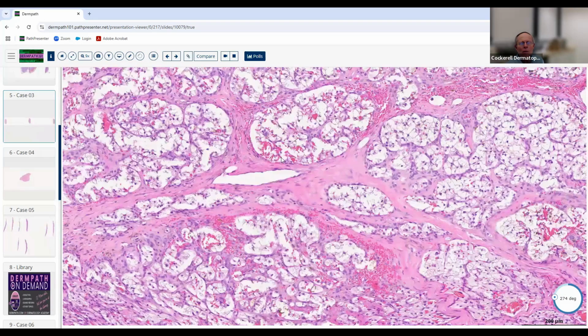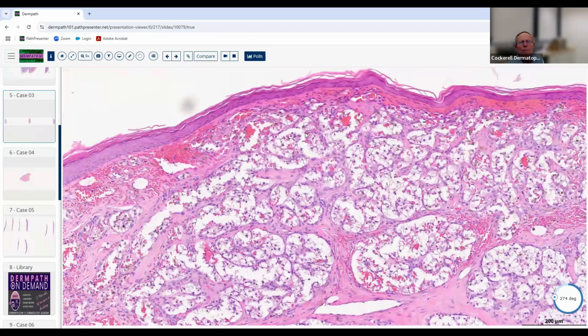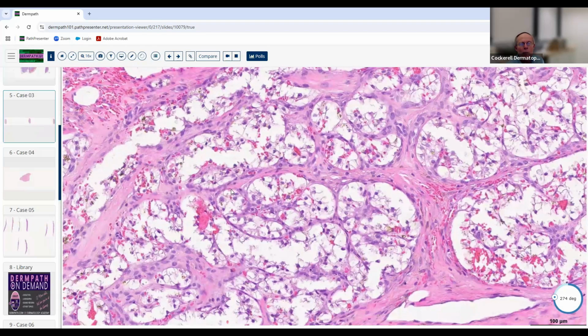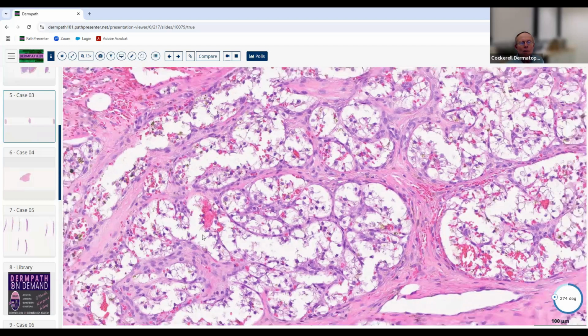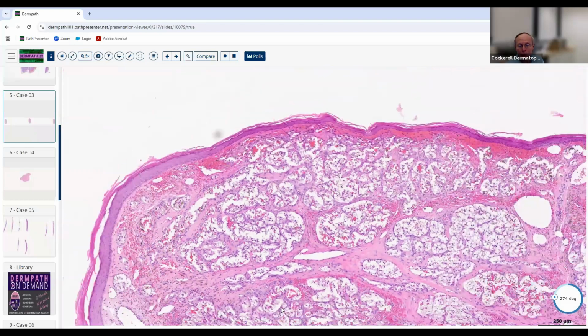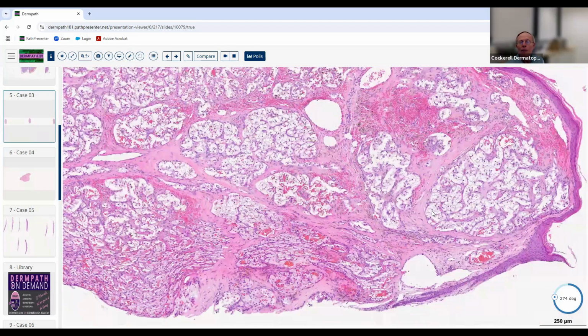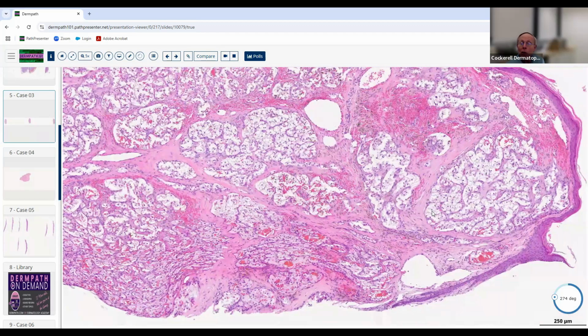They don't look like sebaceous cells, which can be clear staining. They don't look like histiocytes that have a bunch of lipid in their cytoplasm, and all these red blood cells here. And if you look at this little structure here, it's almost recapitulating a nephron in the kidney, like a collecting tubule, if you will, right in this area. So this is an example of a metastatic renal cell carcinoma, and it's one of the entities in the differential diagnosis of clear staining neoplasms in the skin.